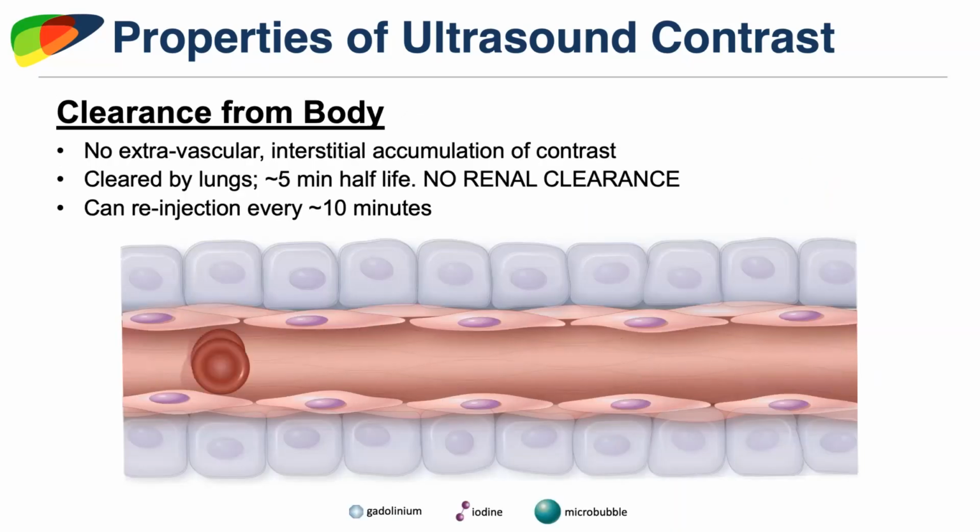Now, one unique thing about this contrast agent is that it's completely intravascular. So unlike iodinated agents and gadolinium-based agents that have an extravascular interstitial phase, microbubbles stay within the vascular space. So it is a pure blood pool agent, and you will not see bubbles where you don't see blood flow and vice versa. The other great thing is that it has a short half-life.